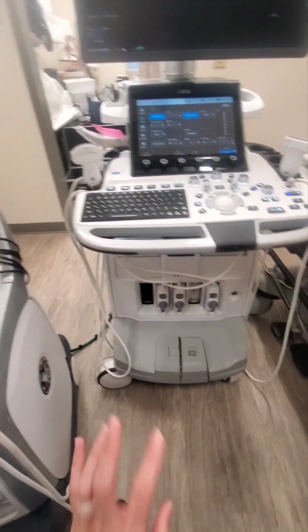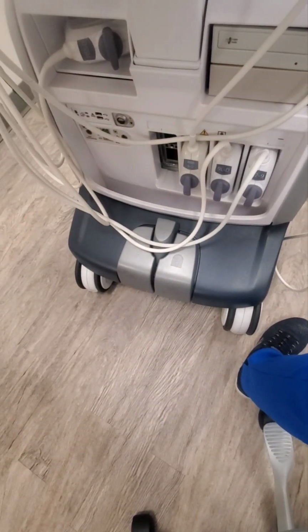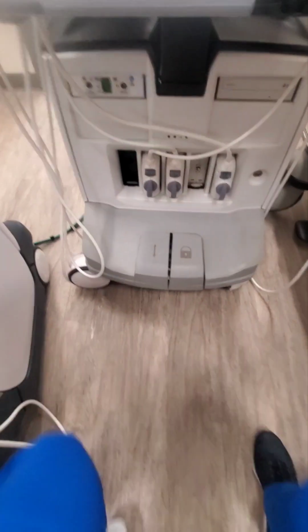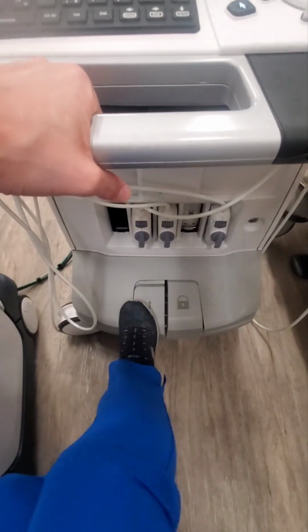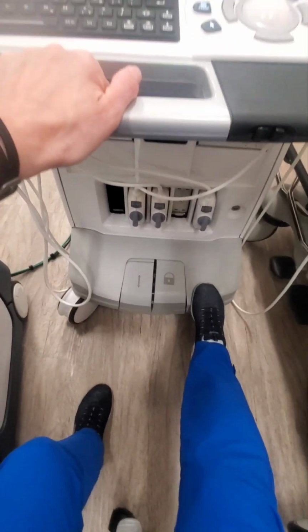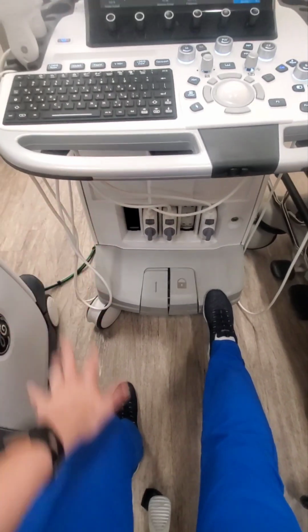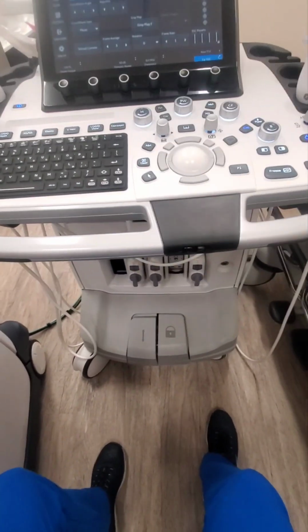The other important thing is the foot pedals. Sometimes they look a little bit different. I just kind of play with them. One is like a locked steering, and will go forward and backwards and lock your wheels for you, so you can go portable and steer your machine without it going wonky all over the place.